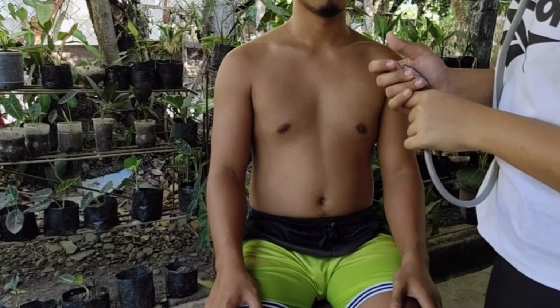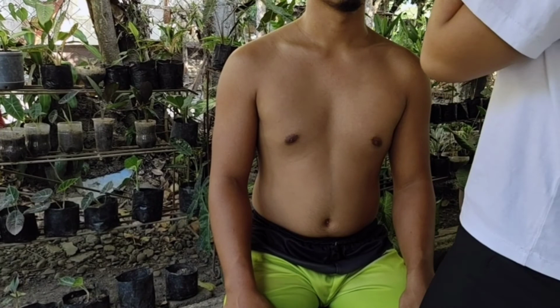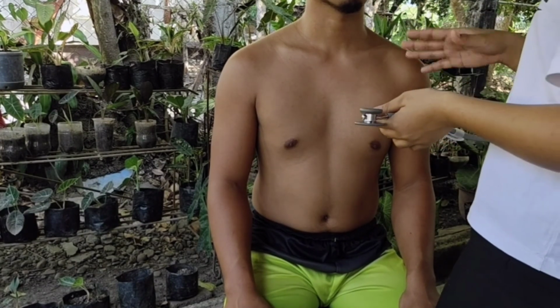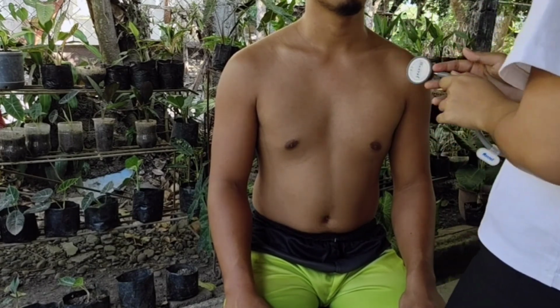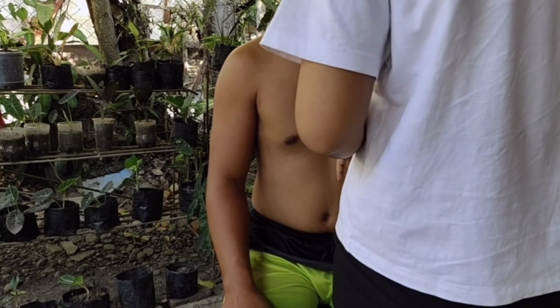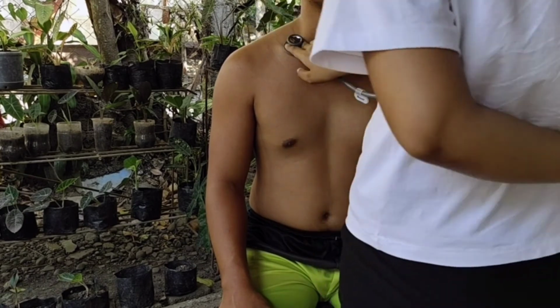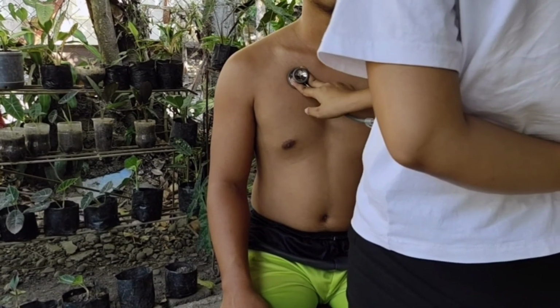Sir, in this auscultation, I'm asking you again to breathe using your mouth, okay? Take a deep breath through your mouth, inhale and exhale. Okay, thank you, sir. Next.